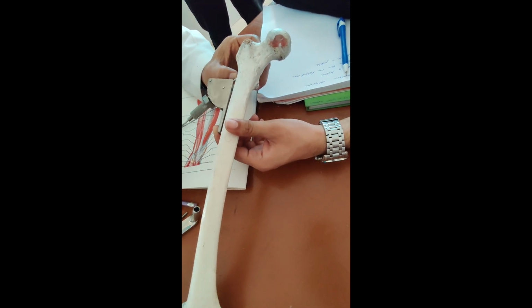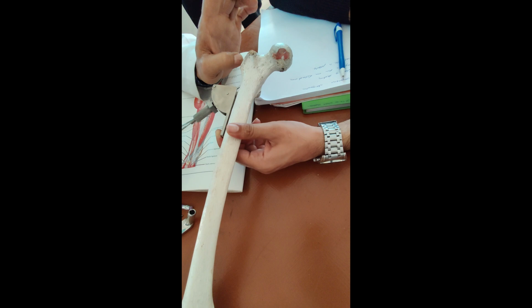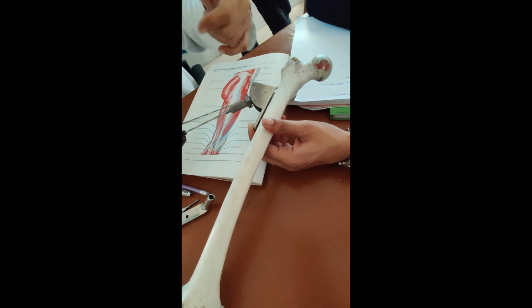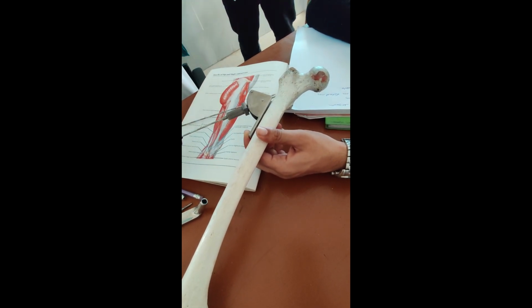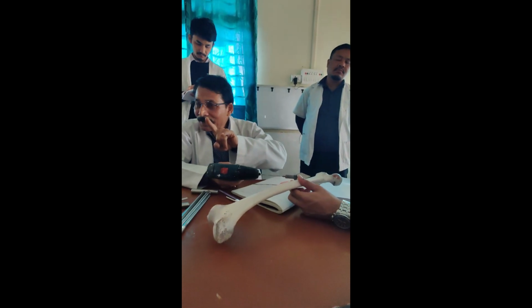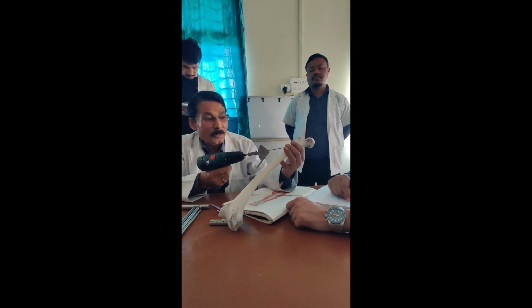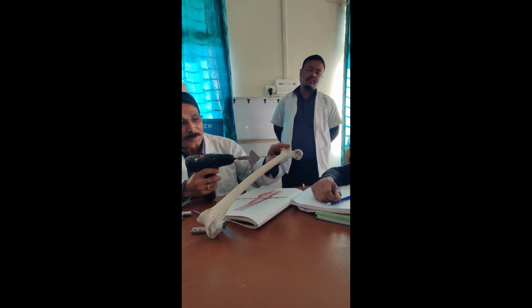Now what next? It is the lateral view. In the lateral view, if you are going halfway, then you are not hitting. I know that my AP view is going to be in the central part. Then my job is only to manipulate whether it is anteriorly or posteriorly. So take the lateral view now. From the lateral view, you know whether my entry point is anterior or posterior. So from this point, you can only manipulate the anterior-posterior part, which means playing the blade either this way or this way, but not this way. That is already fixed by the AP view.